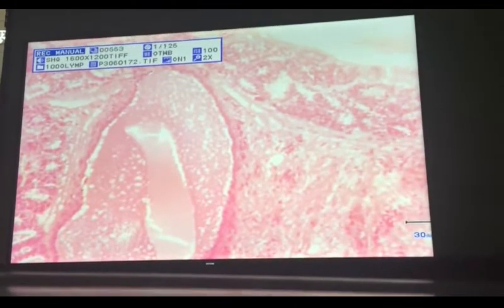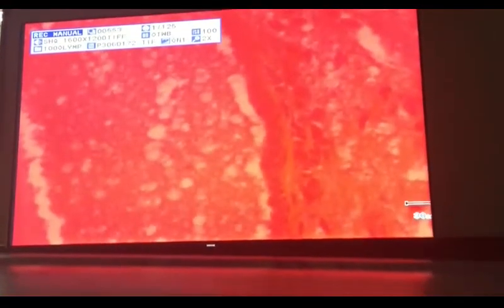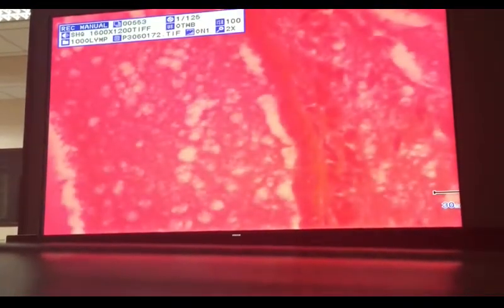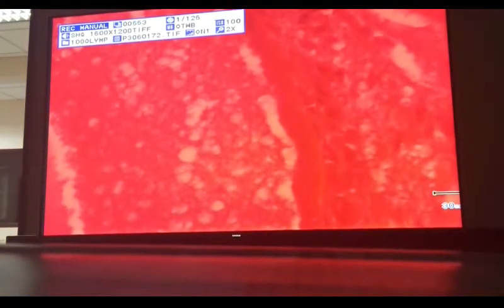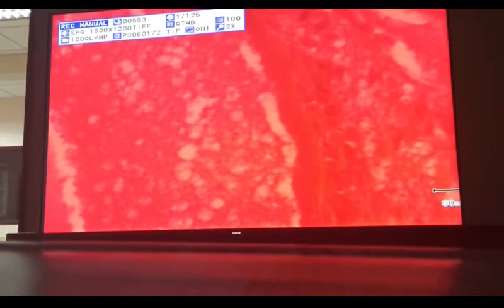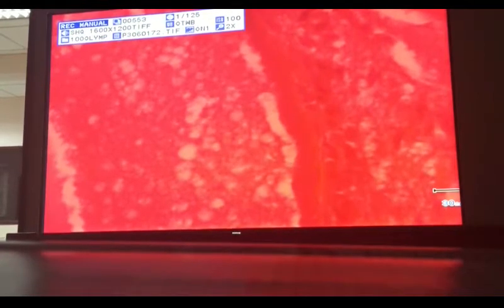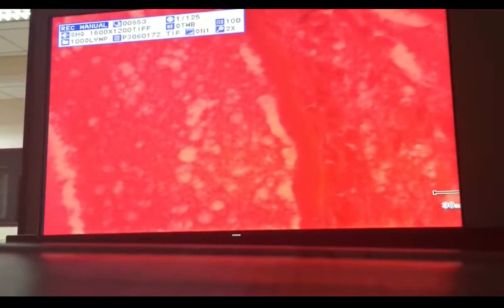Okay? Now, it is an interlobular duct outside of a lobule. So, usually the ducts are lined by what type of epithelium? Simple cuboidal epithelium. That's the simple cuboidal epithelium. It is also surrounded by flat cells. They are also surrounded by myoepithelial cells. So the myoepithelial cells are present surrounding the acini and the ducts, intra and interlobular ducts.